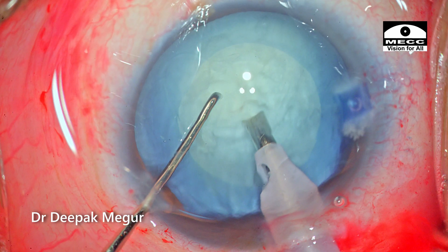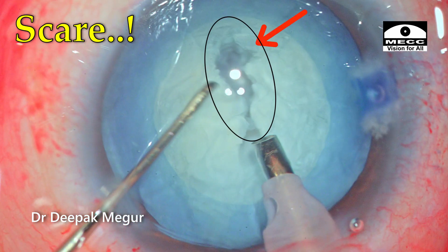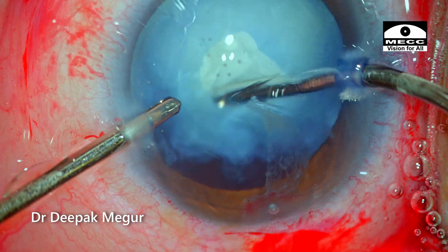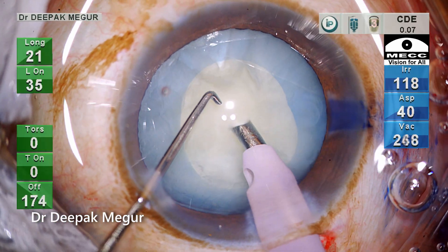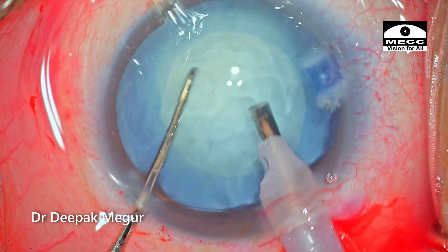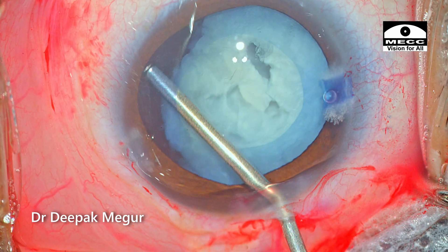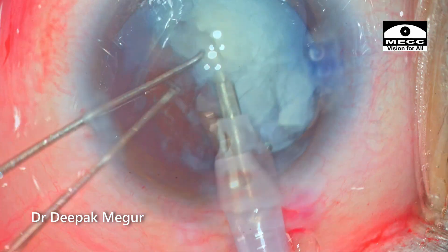To summarize, I did have a momentary scare when I felt the sudden jerk and the formation of the hole in the nucleus. This case teaches us that one needs to be very much aware of the density of the nucleus being dealt with. In such cases it would be better to start with zero energy and then increase it only as and when required. In certain tricky situations like this one with an extremely soft nucleus, it would sometimes be safer to simply displace the soft nucleus out of the bag using OVD and then aspirate it in the anterior chamber.